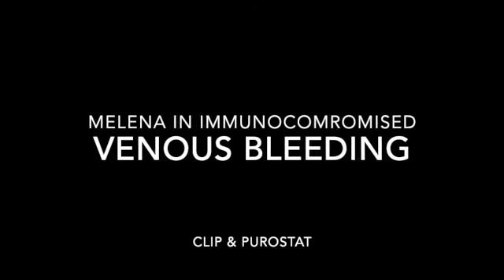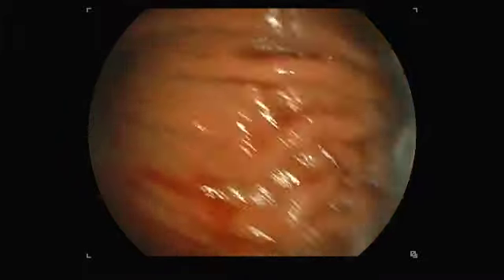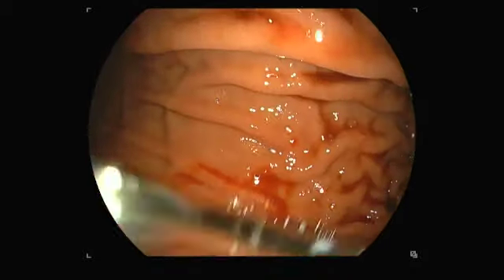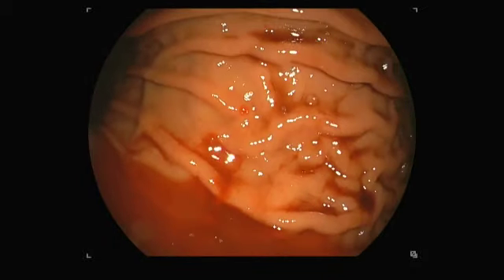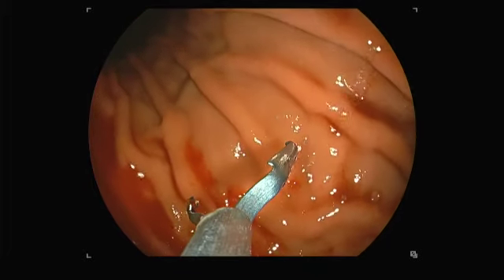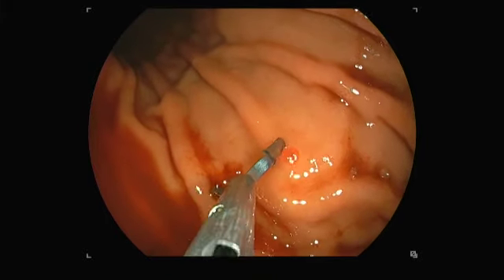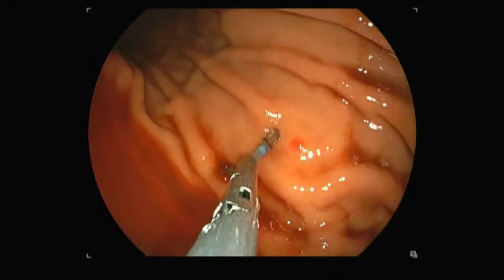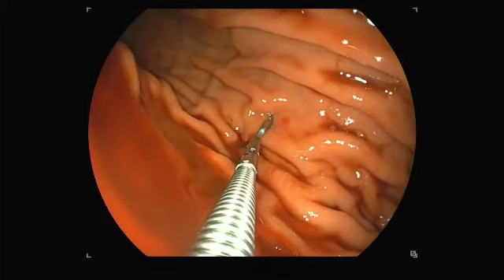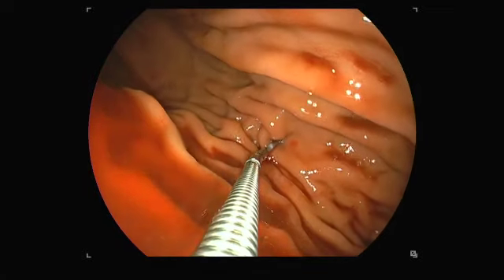Greetings. In the previous video, you have seen how we identified the source of bleeding in this young patient with refractory acute lymphatic leukemia who is waiting for CAR T cell therapy. We found this punctate bleeding, not an arterial sputter. There is no ulcer, but continuous ooze. His platelet count was running in the 15 to 20,000 range.